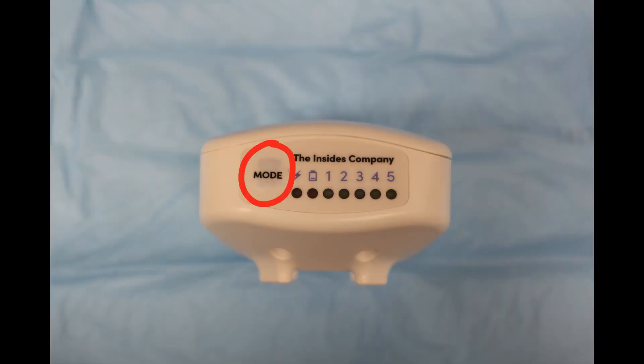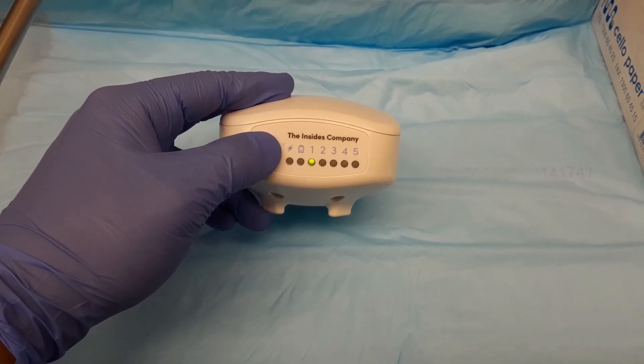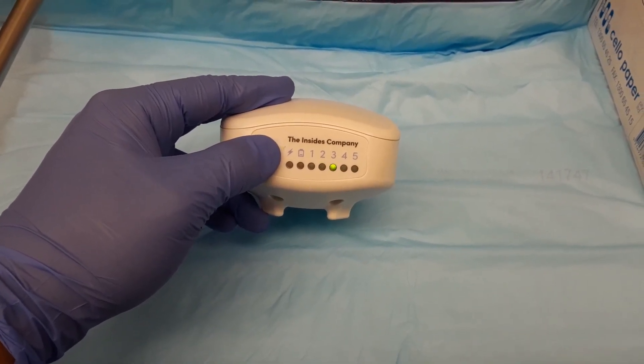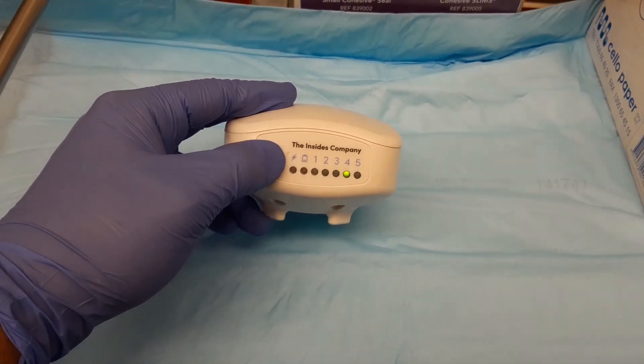To turn on the driver, the mode button is pressed. Pressing the mode button will work up through the different mode speeds as indicated by the green light. To turn off, the mode button is pressed until mode 5 is reached and then pressed again; the green light will turn off.